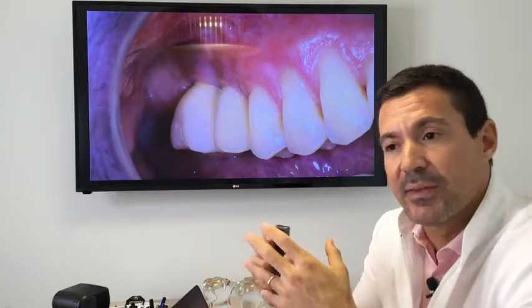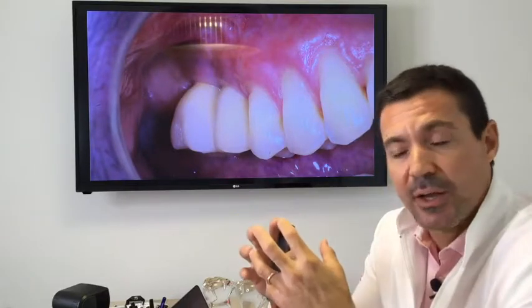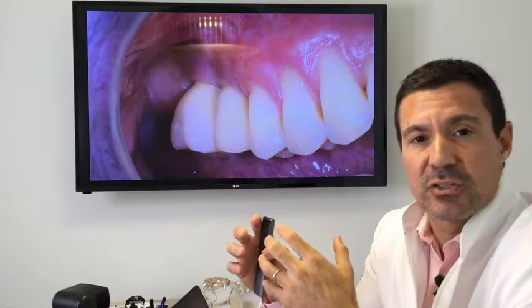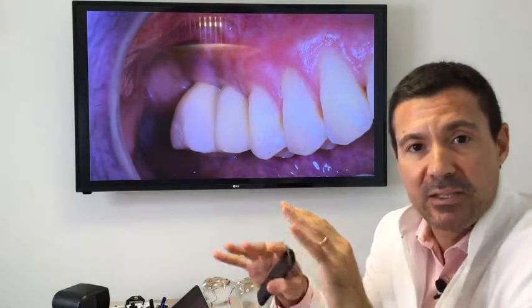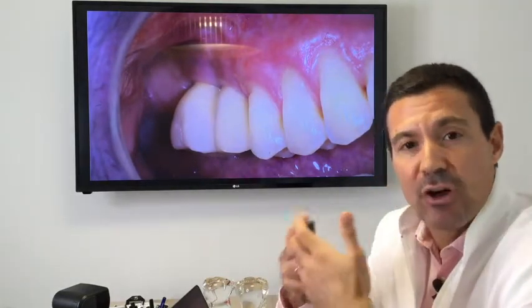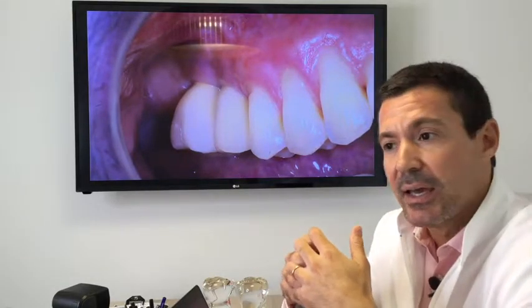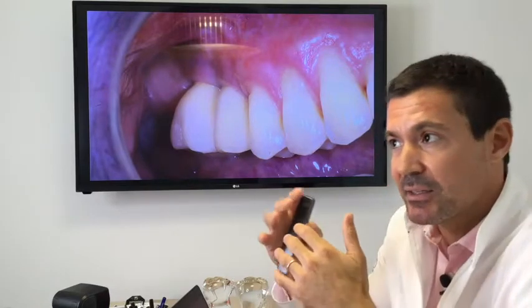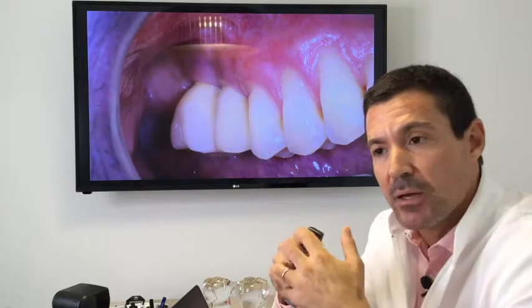I strongly recommend that when we see cases like this, where a structure is moving, we check different factors. One of the factors would be occlusal control. When the patient has no occlusal control and there is an unbalanced bite, obviously this is not a functional bite. This is not a soft relationship between the uppers and the lowers. If the patient also has a parafunctional habit, it's another factor that gets added to the other factors that might increase the problem.